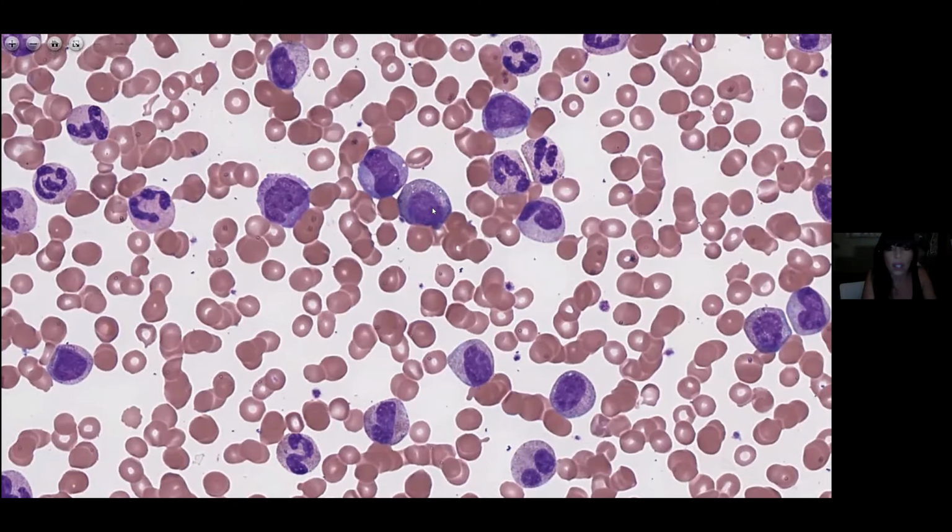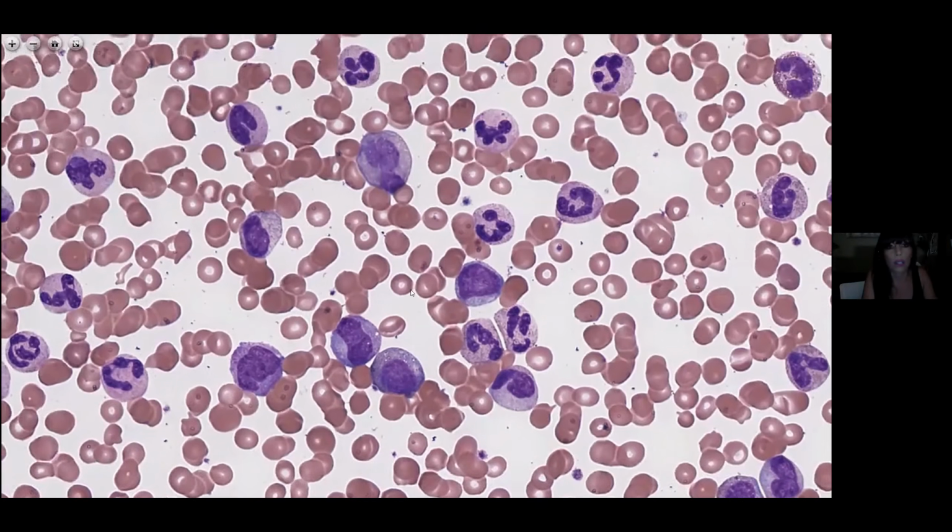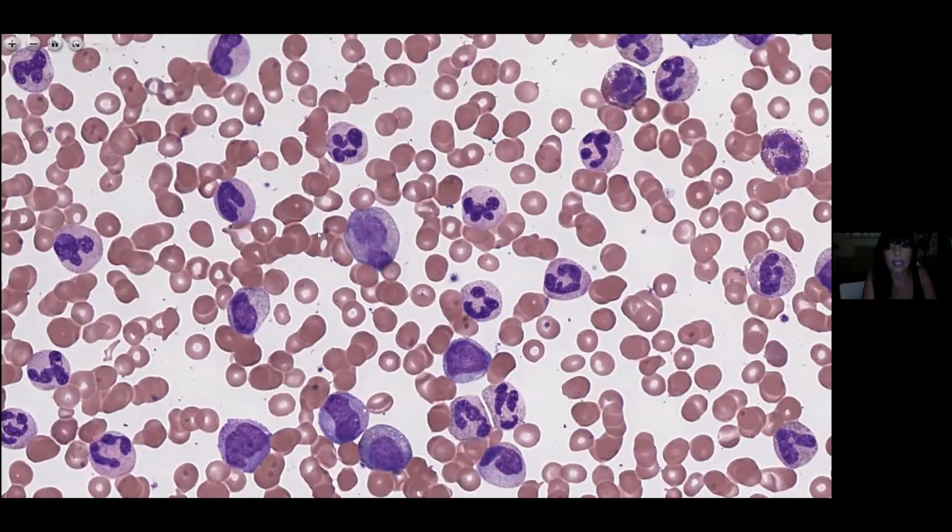This myeloid cell here has an oval nucleus, some chromatin clumping. One of the sides is starting to flatten out, but it is not indented. And it has some of those secondary granules. And some more bands and segs.